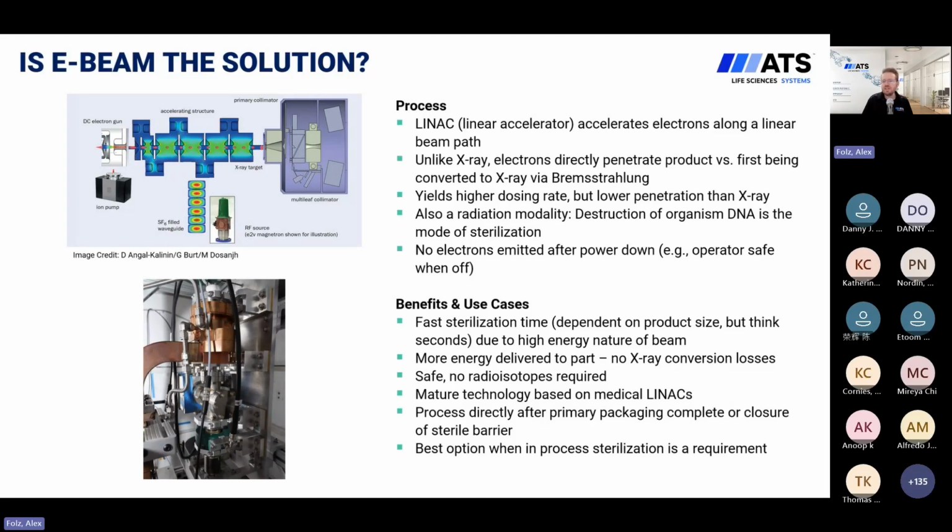Similar to the other radiation modalities, right? Destruction of the organism DNA is the mode of sterilization. And again, once we turn off the system, once we are done sterilizing product, no electrons are emitted after power down, and it becomes operator safe very rapidly after power off.